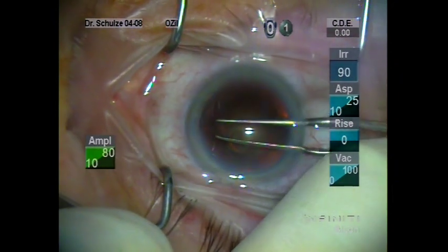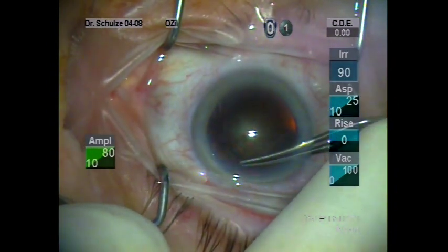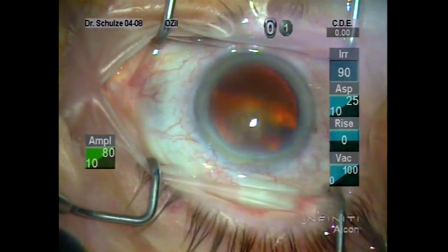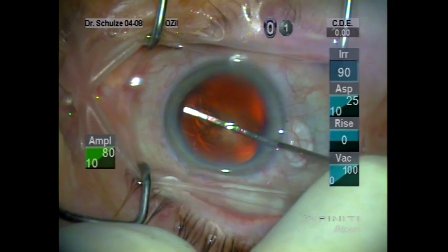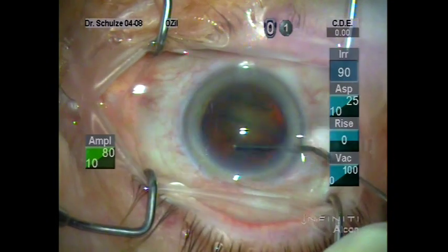I prefer to move in a counterclockwise direction, as you can see here, although of course you can do your capsulorhexis clockwise as well. I then use a flat cannula to inject BSS underneath the anterior leaflet of the capsule. It's important to elevate the anterior capsule as you inject.